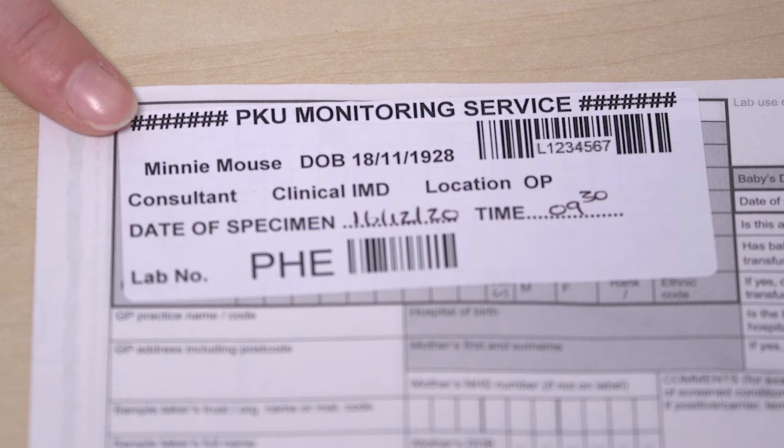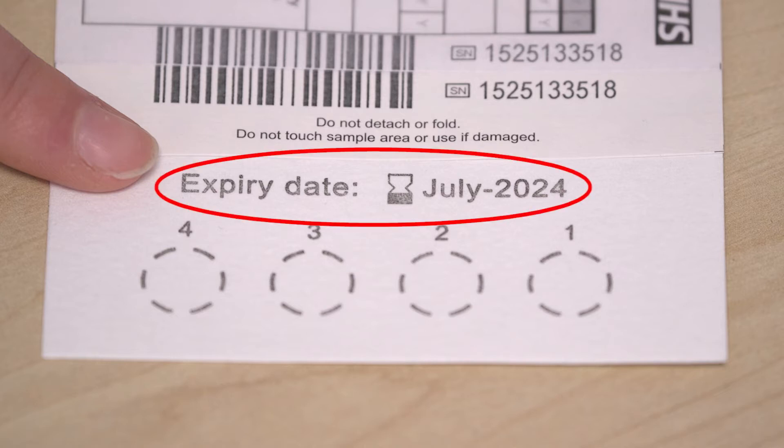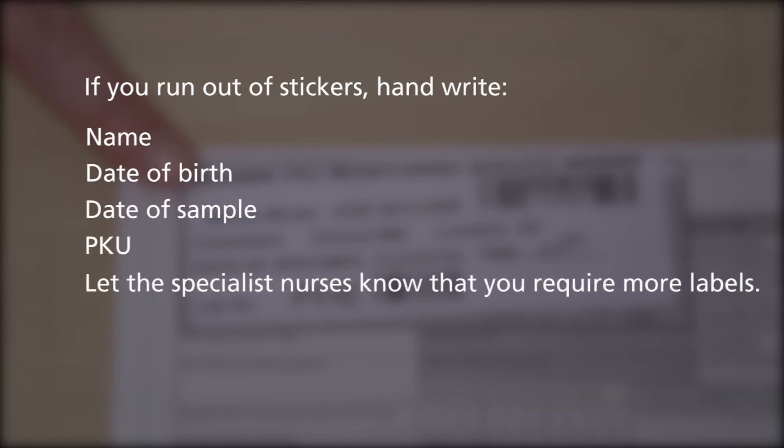Use the stickers that the hospital have provided for you on the card. Make sure the stickers have the correct name and date of birth of your child on them. Make sure that the blood spot card is in date and valid to use — the expiry date is on the end of the card. If you run out of stickers, then handwrite the name, date of birth, date of sample, and PKU, and let the specialist nurses know that you require more labels.